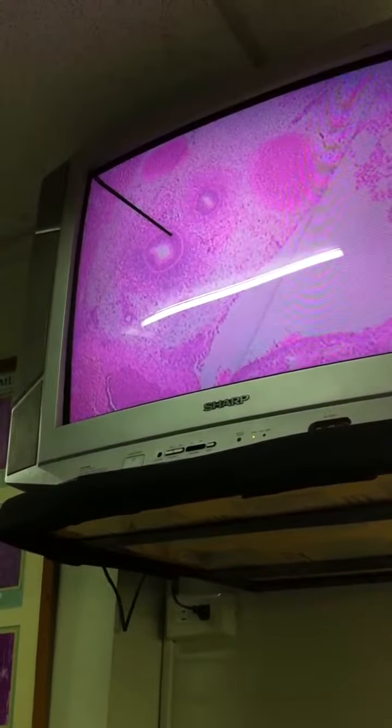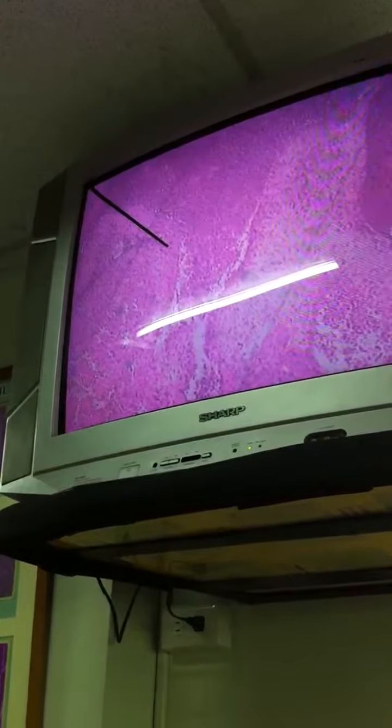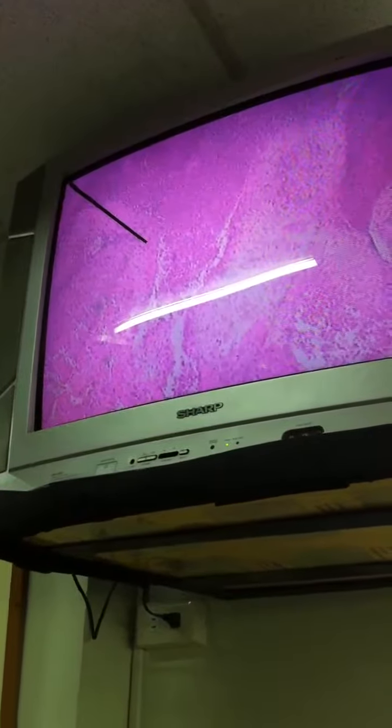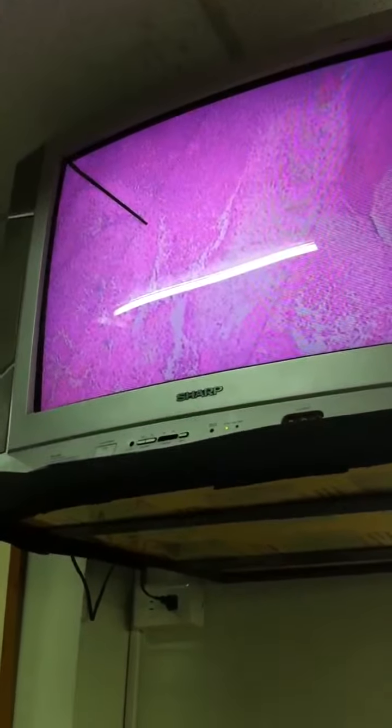If you find them, below that, you will find the developing heart. This is the entire developing heart. If you compare this with your atlas, this is exactly what you will see. So, esophagus, trachea, developing heart. Now let's look at the parts of your developing heart. Remember, let's look first at the chambers. Your heart has 4 chambers.